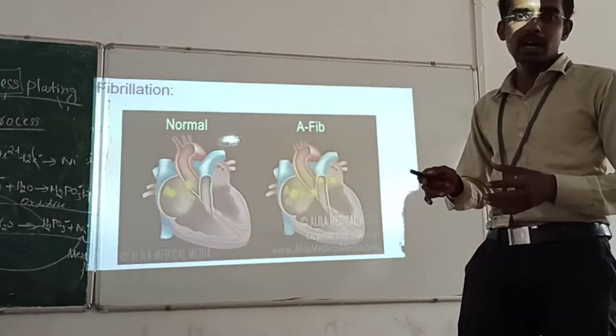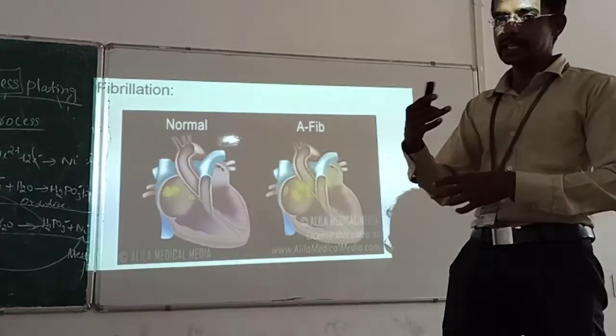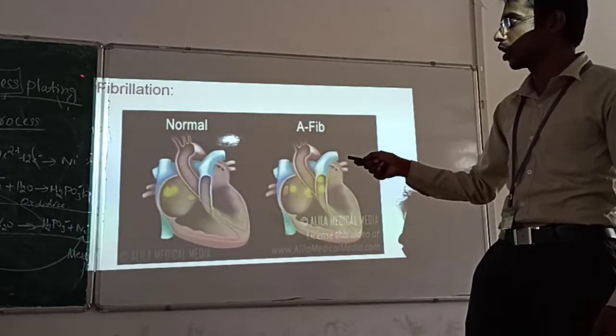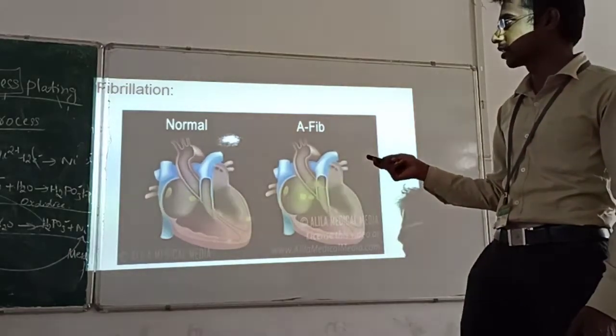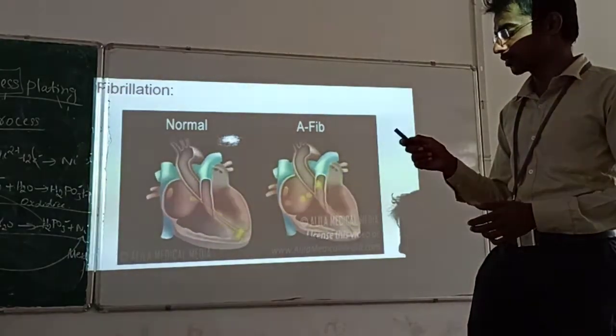Fibrillation is malfunctioning of the heart. Defibrillation means resetting the malfunctioning of the heart to normal functionality. That is why we call it a defibrillator. Fibrillation is quivering, and defibrillator means stopping this quivering of the heart.